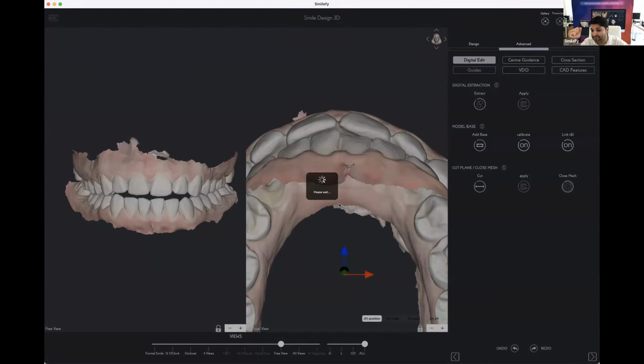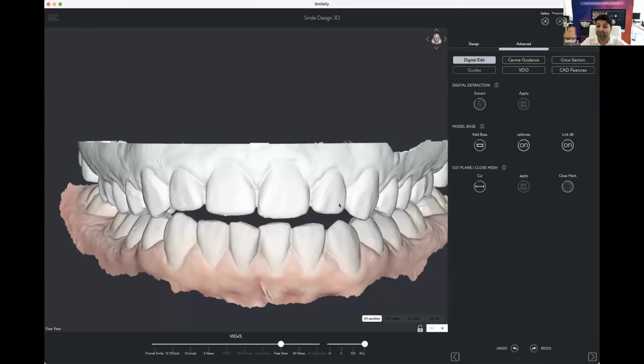Shimbashi, thank you very, very much. I always forget this name, and I cannot forget this name because that's a huge reference. And Dr. Shimbashi is a huge researcher in the vertical index, right? And this study is integrated now in our app so that we can go with the optimal vertical index CEJ to CEJ.